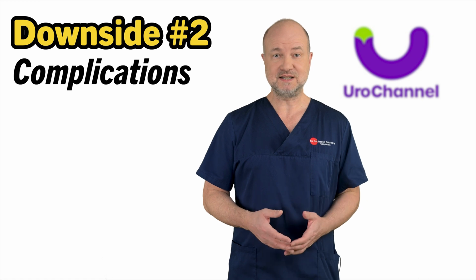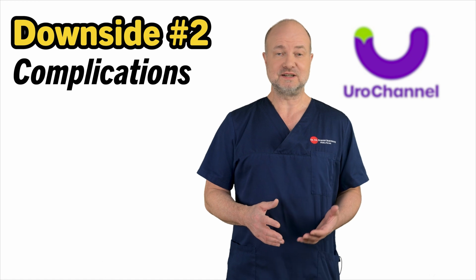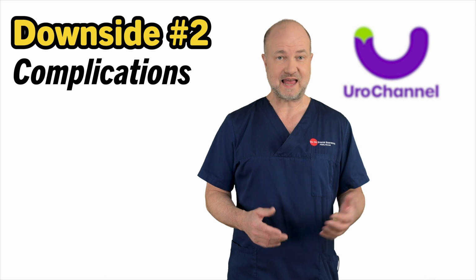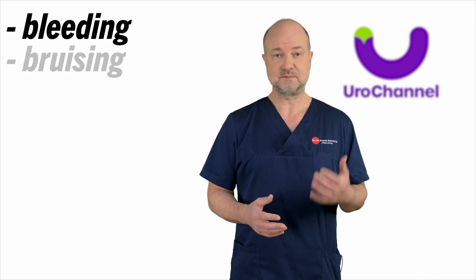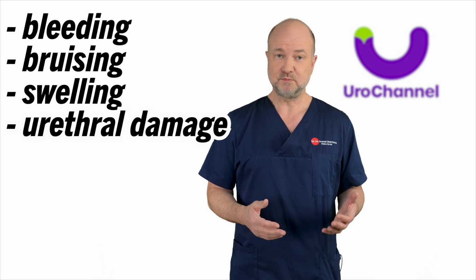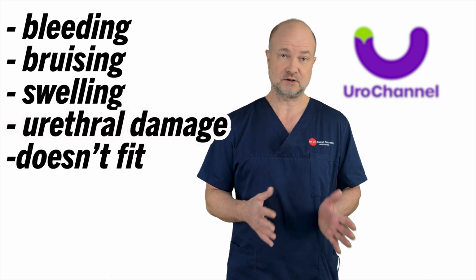Downside number 2 is complications. Getting a penile prosthesis can be life-changing for men with severe erectile dysfunction, but like any surgery, it comes with risks. Modern implants are safe, but some complications can still happen. Surgery may cause excessive bleeding with subsequent bruising and swelling. The urethra may be damaged during the procedure, which would be a severe complication. After the surgery, the implant may turn out to be too short or too long.